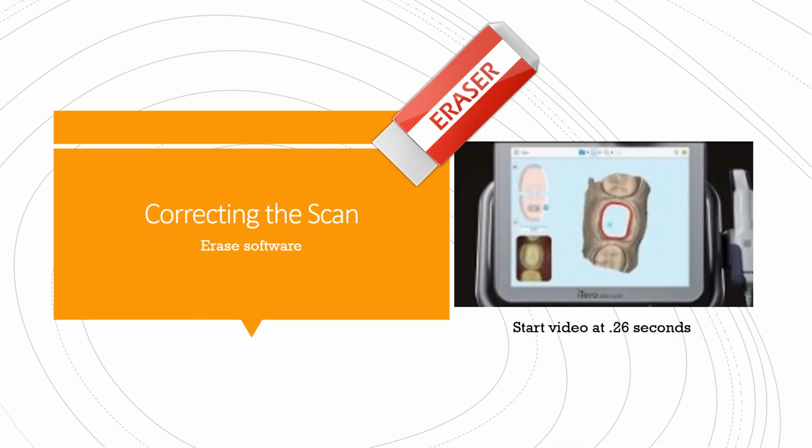Correcting the scan. Some units have the ability to erase a scan to allow the operator to correct a portion of that scan and rescan only the specific portion.